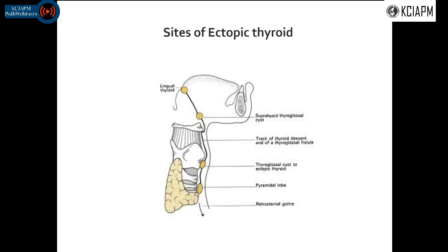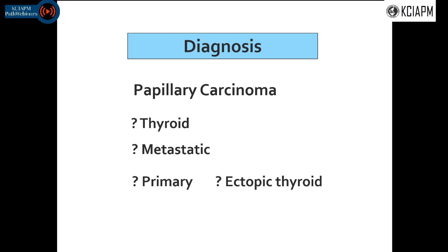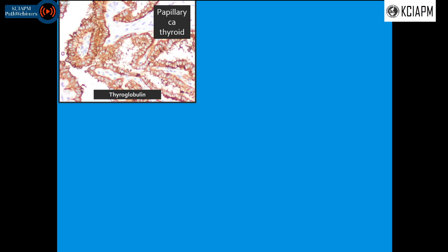So with this, to recollect, where could ectopic thyroids be? Starting from lingual thyroid going down up to the retrosternal area in this tract. And whether we are dealing with a lesion arising in this region of the lingual nasopharyngeal area? A bit far-fetched. But again, we go back to the routine exercise of primary, secondary, where the ectopic thyroid was normal in this child.